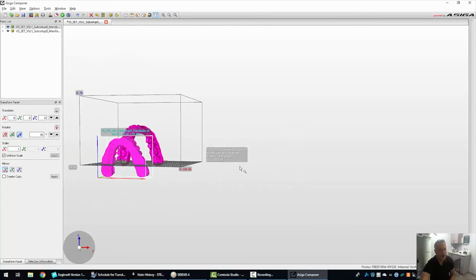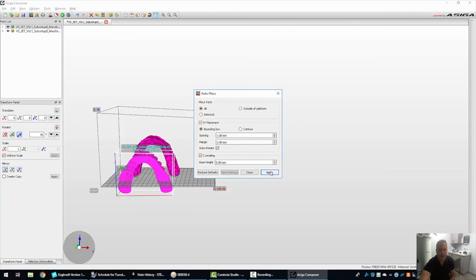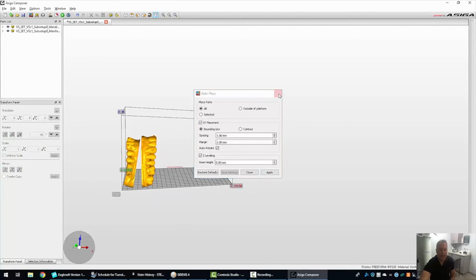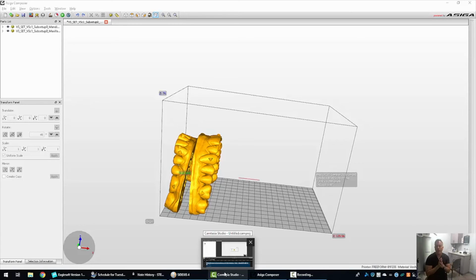So now I've got models here, but look, they're not on the build plate. However, there is a cool step. If you go to the top, there's this little icon that says auto place. And if you click that, it'll go ahead and put the models on the build plate in a sort of good orientation.